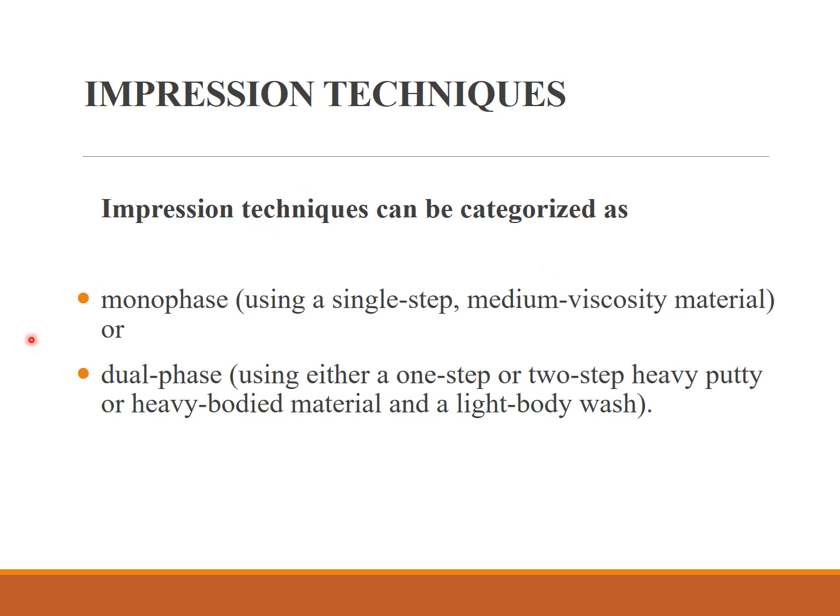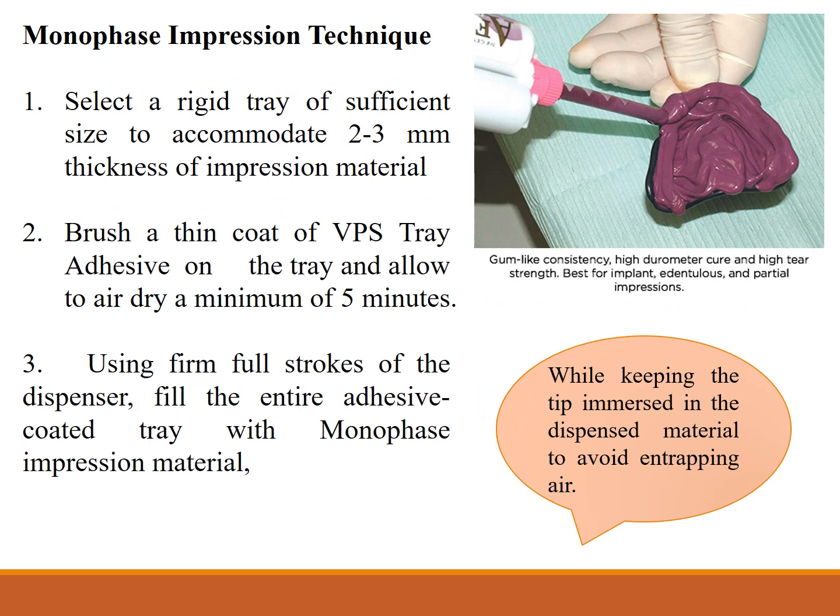Impression techniques can be divided into monophase and dual phase. Monophase is usually a single step. Medium viscosity material is used. Dual phase is using one step or two step, heavy putty, heavy bodied, and light body wash. Okay, and spaced and non-spaced.